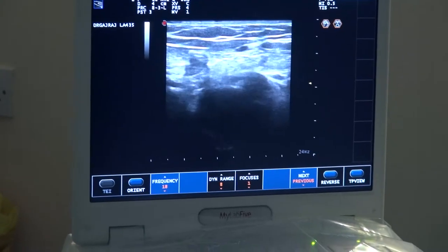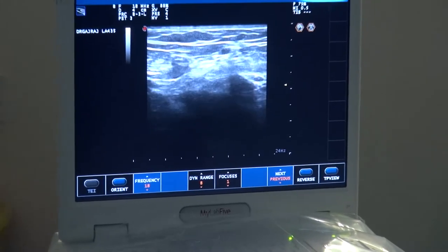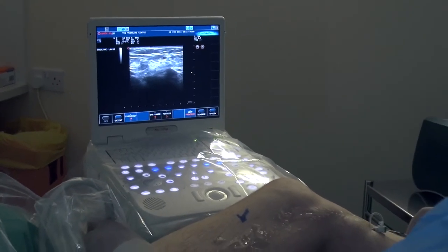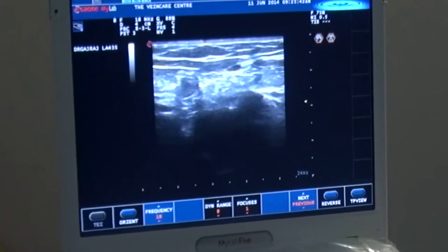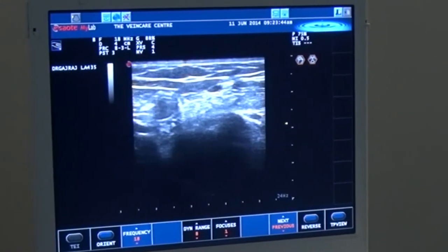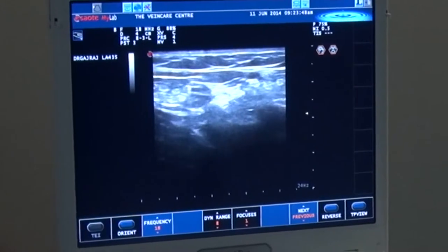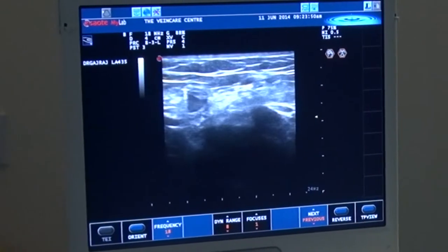As we can see now, as we advance the catheter, in a moment we're going to see a little white dot appear in Mickey Mouse's right ear. There it is — you can just see a little white dot appearing in Mickey Mouse's right ear, i.e. the left of the screen, and that indicates that we're very close to the junction.